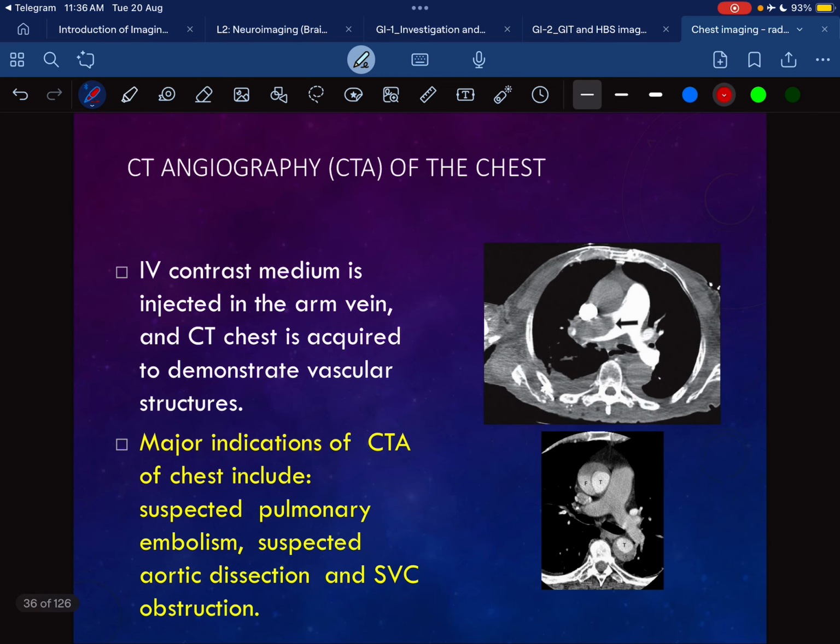Pulmonary angiography is where we're using contrast to assess the pulmonary artery. How can we do it? Has anyone attended any PE study before? How do we inject the patient?